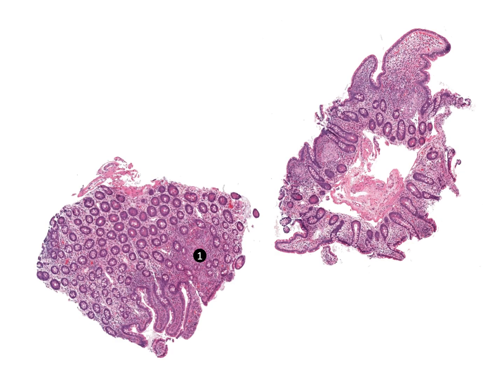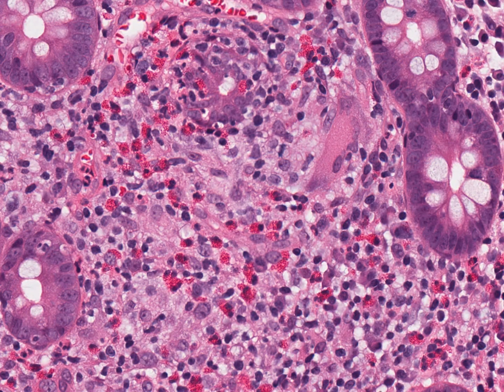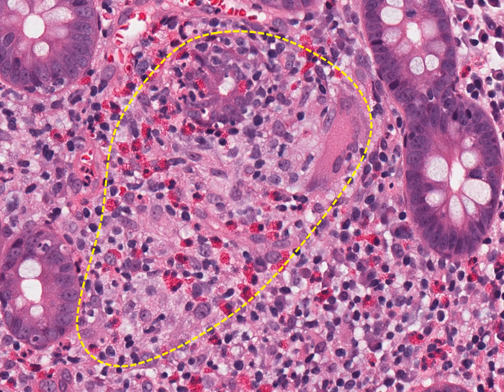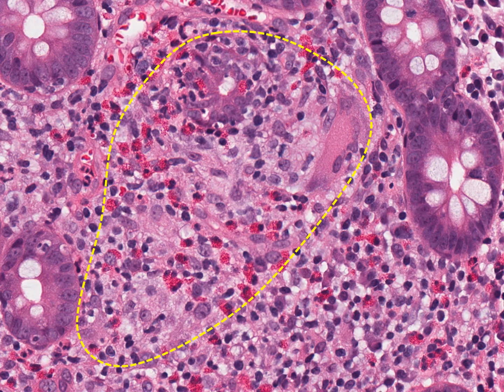This poorly formed granuloma is arising from a damaged crypt — a cryptolytic granuloma. Its outline is not precise. Cryptolytic granulomas can form around any ruptured crypt, whatever the underlying etiology. They are non-specific and are not informative about the etiology.